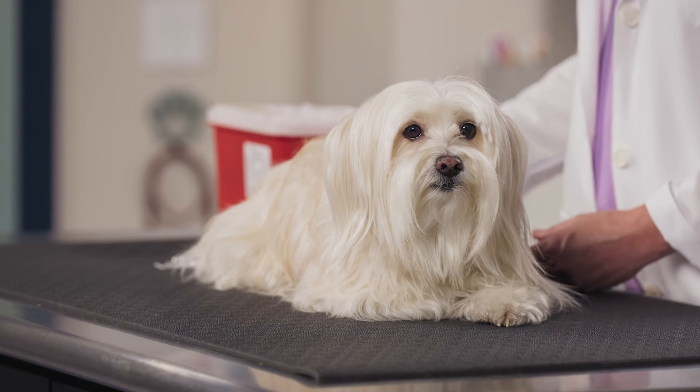Speaking of treats, it's very important that you feed your pet before administering the insulin. Most will need insulin twice a day, so they'll get their injections with their morning and their evening meals. Charlie here doesn't need insulin, but he's here with us today to help demonstrate how to administer a dose.